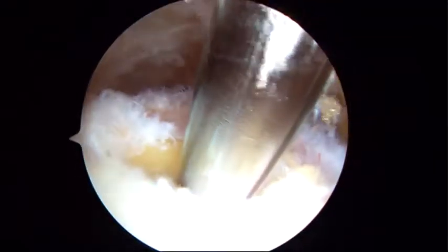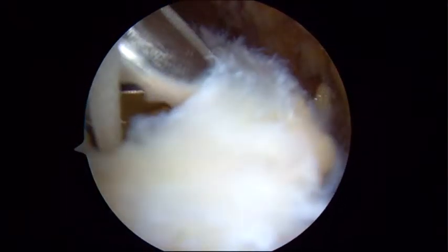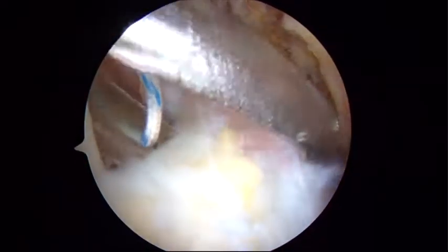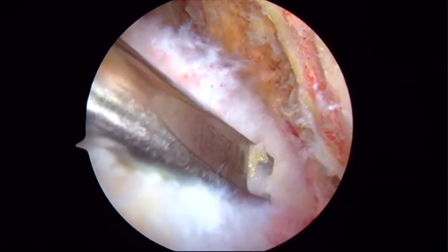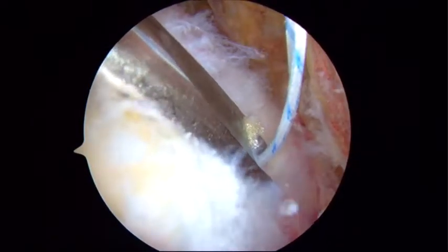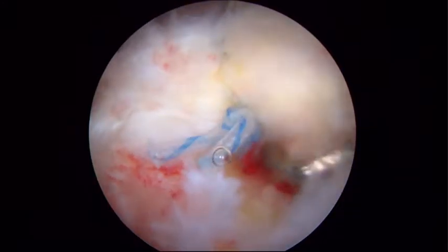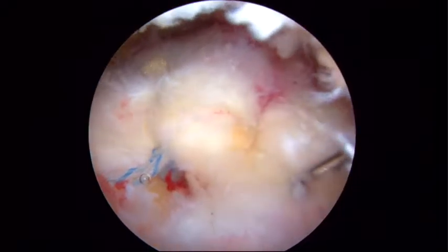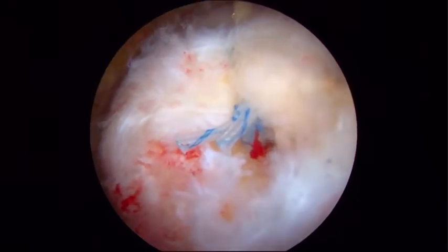Once the anchor is in, this is pretty much a standard repair. We'll use a grasping, penetrating device to put the sutures through the cuff, and we'll put one through more anteriorly and retrieve it out the paracromial portal. Here's our second suture that's been placed. Here's the completed repair viewed from the direct lateral portal with the probe coming from posterior. You can see we have dented down the tendon, but we haven't crushed it, so you can still see vascularity in it. And that's what we're looking for in a single row repair.